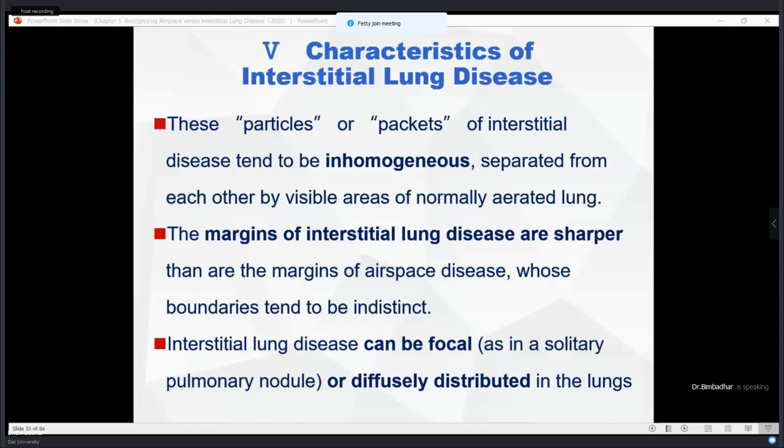Now, the pathology related to the reticulonodular pattern, a specific example of the most common type of disease that we see, is tuberculosis. Tuberculosis generally gives a reticulonodular pattern. We will come to it in the last parts, while we are recognizing the patterns; we have these examples. Okay, don't worry, I will explain it in the coming slides.